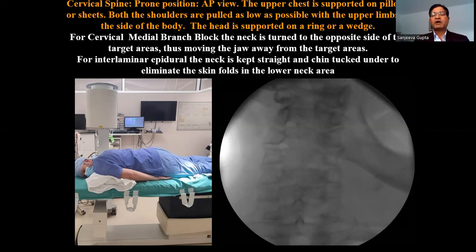So we've discussed thus far about doing the procedure either in lateral or supine position, but I prefer lateral, so I've chosen that. But even if you're doing in the supine position, the images are exactly the same. The orientation will be slightly different, but you'll have to superimpose the articular pillars and then do. But the other way of doing it is in prone position.